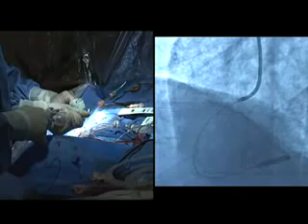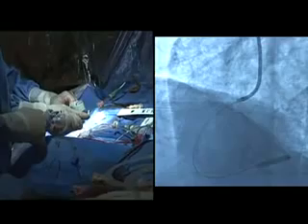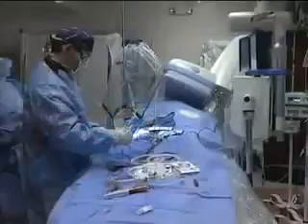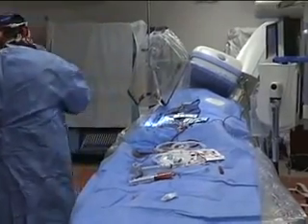The stent is deployed, crimped on a balloon, and we expand the balloon, which is what we're doing right now, and that will leave the stent in the vessel. The balloon will then come down, and the stent will remain fully expanded in the vessel. So right now we are forcing the stent, for lack of a better word, into the wall of the artery with a high-pressure balloon. And in about 30 seconds, we'll remove the balloon and leave the stent. The first stent we placed in the distal most part of the artery, which is at the end of the artery. And this is the stent that will go in the proximal part of the artery.